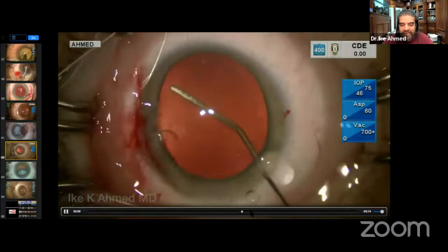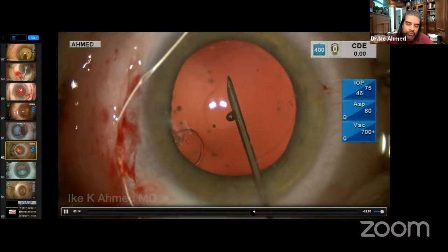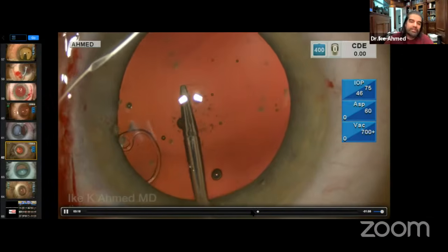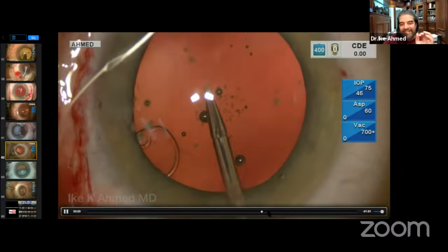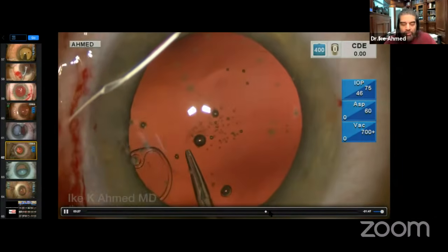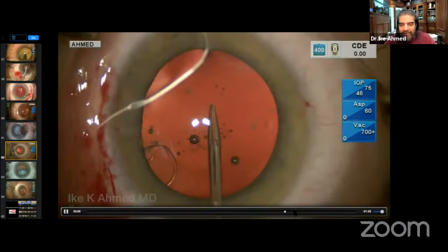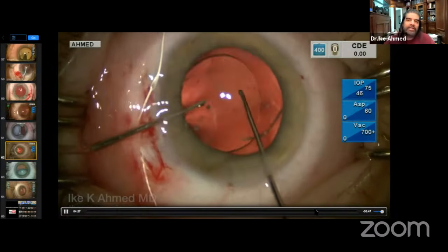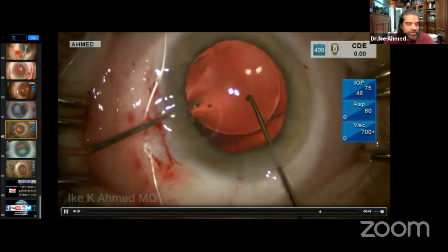And even with the CTR and CTS in, you can see we're also doing a posterior rexis in this case. Again, start the rexis with a sharp needle, bevel down, inject viscoelastic, and then do your capsular rexis. And be sure to try to get it centered here and make it not more than 5 millimeters, maybe a little bit less even. So if you wanted to, you can also do a posterior optic buttonhole. And by that, I mean basically put the lens in the eye, as you'll see, and prolapse the optic behind the capsulotomy. So those are just some tricks and pearls, Arup.